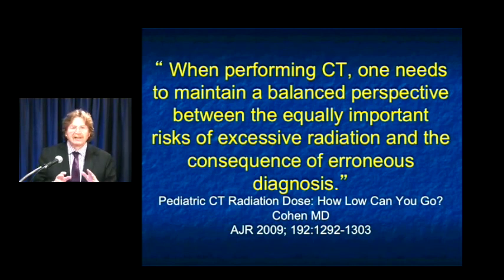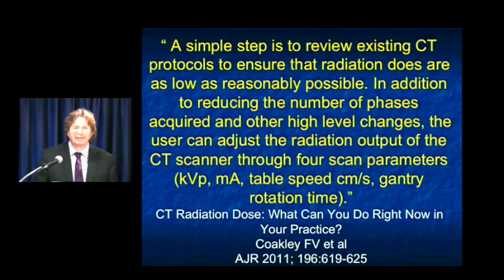You remember we had this ALARA principle, as low as possible. Well, now it's changed to as low as allowing you to get the information you need. And that's really a balance. You can make a very low dose scan, but it also has very limited information and you have misdiagnosis. So again, it's a balance.